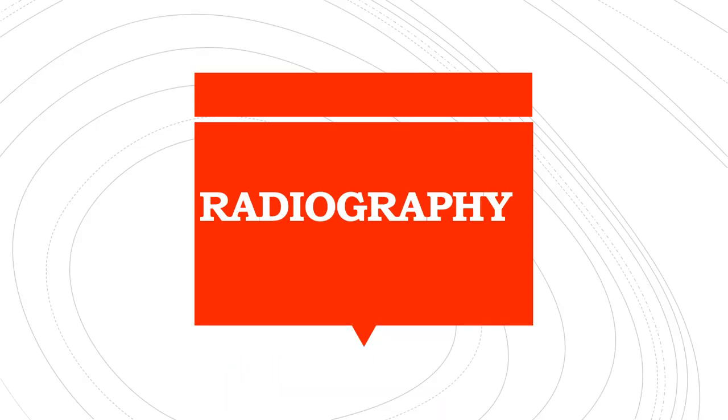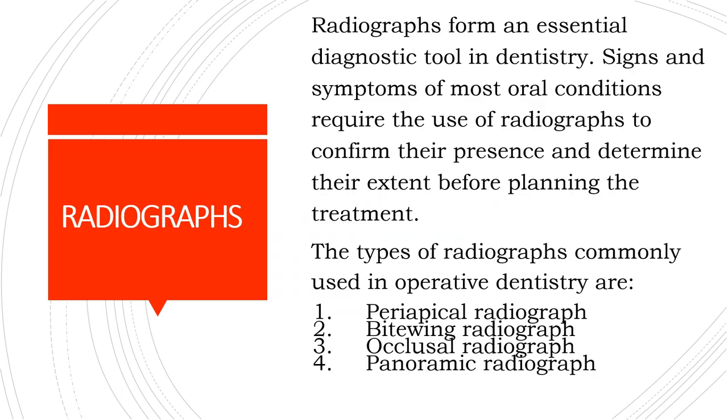Coming to radiography. Now, radiographs, we know, form an essential diagnostic tool in dentistry. Signs and symptoms of most oral conditions require the use of radiographs to confirm their presence and determine their extent before planning treatment. And the radiographs commonly used in operative dentistry are periapical radiograph, bitewing, occlusal radiograph, and panoramic radiograph. Let's have a look at these.